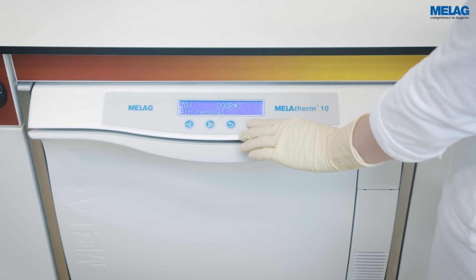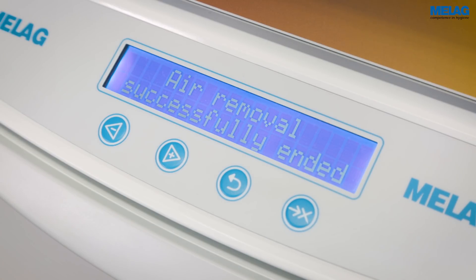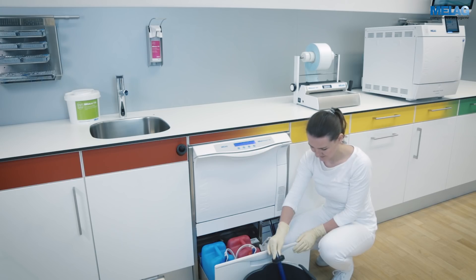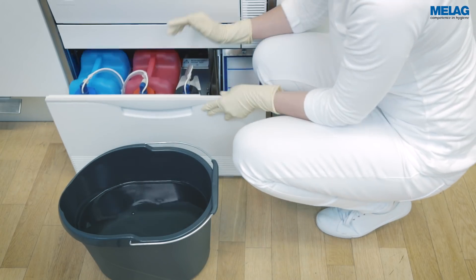Run the air removal program to free the metering system from process agents by rinsing. Afterwards, please return the suction lancers to the process agents.